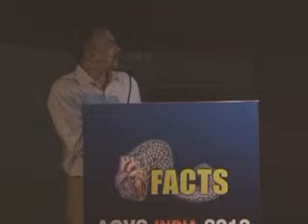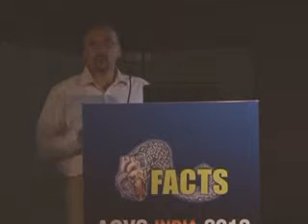Why does this Amplatz catheter get such excellent support? It sits on the floor of the aorta, number one. Two, it takes support from a little more of the ascending aorta. And the third and most important thing is, when you inject contrast, the terminal few millimeters of the Amplatz catheter is not in line with the force that you use to inject.